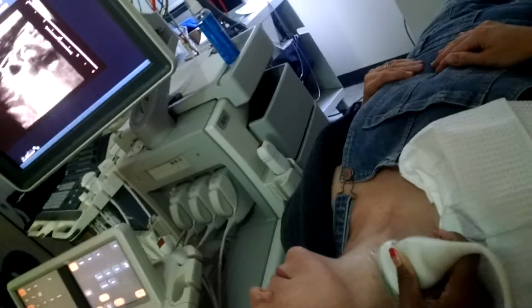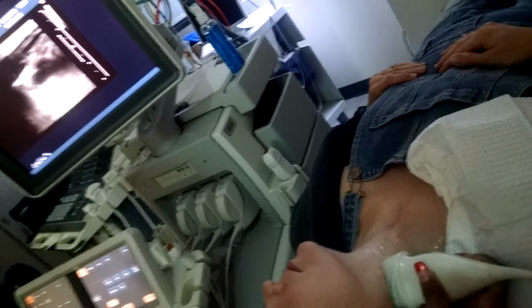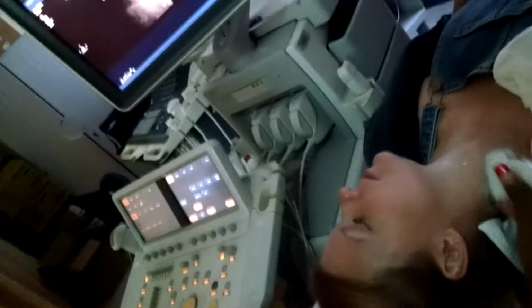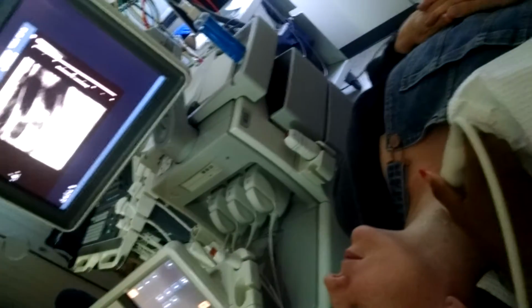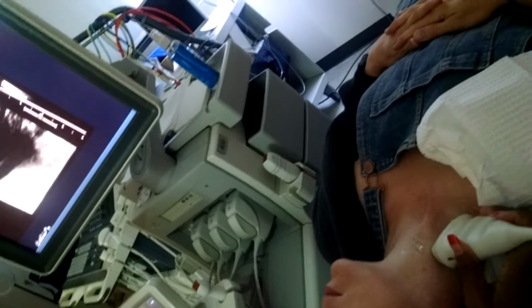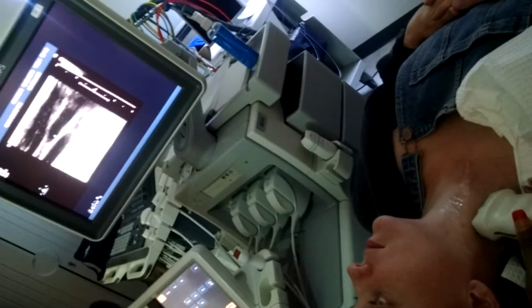And then I'm going to come more lateral, and then I'm going to come more posterior. We're doing a frozen of each of those. Okay? All right? And then I'm going to go longitudinal. I'm going to start down by the clavicle as proximal as I can get. I'm going to check the different approaches to see which is the best approach. Become more lateral on her neck. And I'm going to come more posterior on her neck.